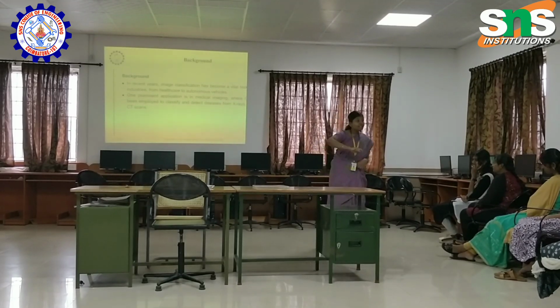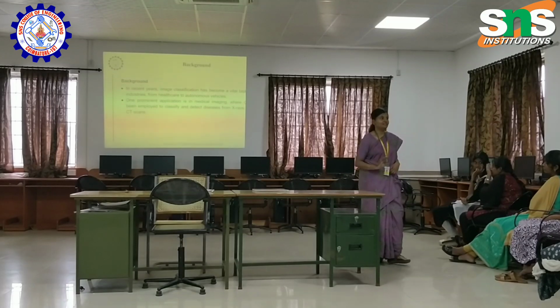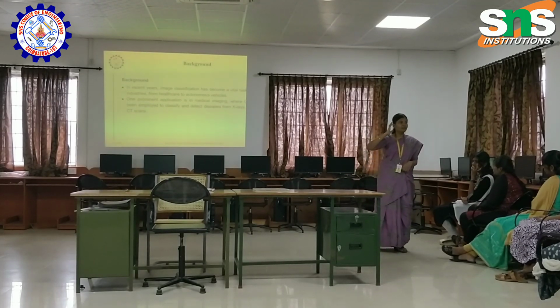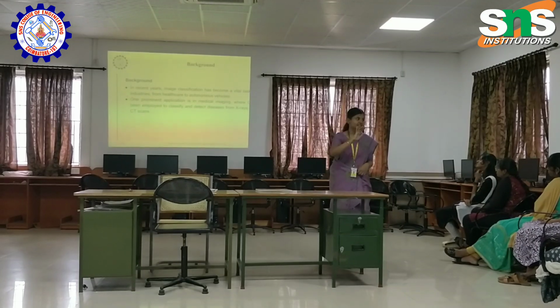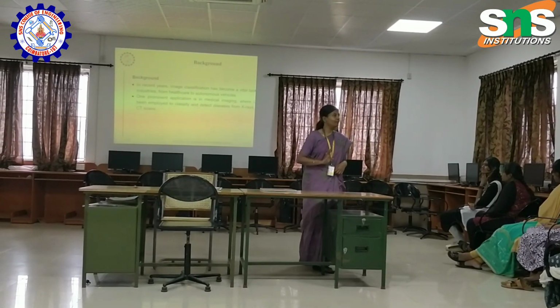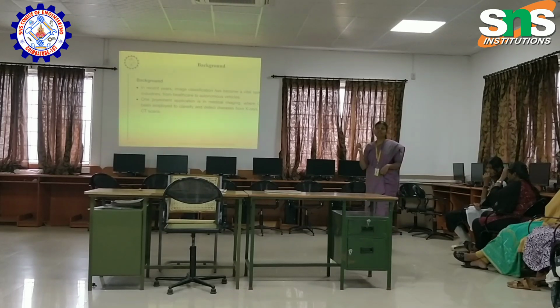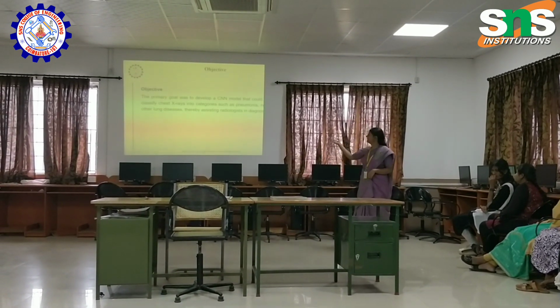So for that, initially we need to train the algorithms using a training data set. The training data set should have the normal patient's scan reports and then the abnormal image scans also need to be included. Only then the ML algorithm will learn the images and it will classify normal and abnormal images.